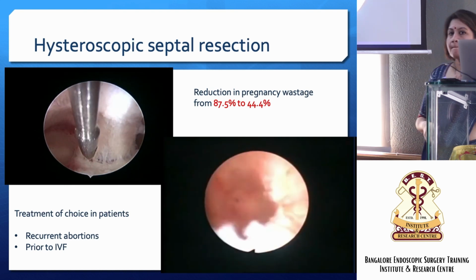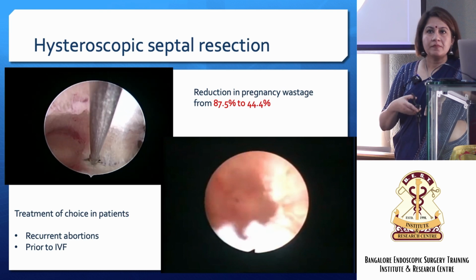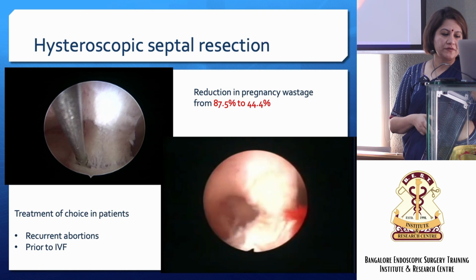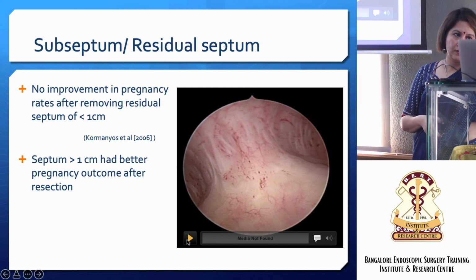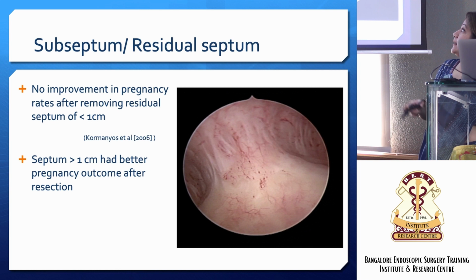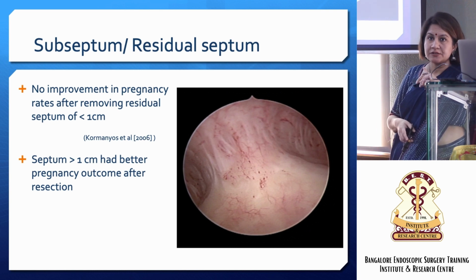Really have the control. This is bipolar. I'm not sure, it's not my video, it's somebody's. See, the other thing is another controversial one. This was a residue. Okay, this is not planing. Anyway, this is a residual septum. Sometimes we see a subseptum like this also.